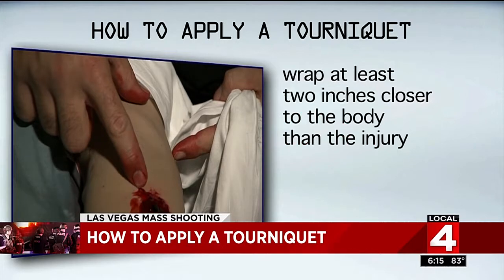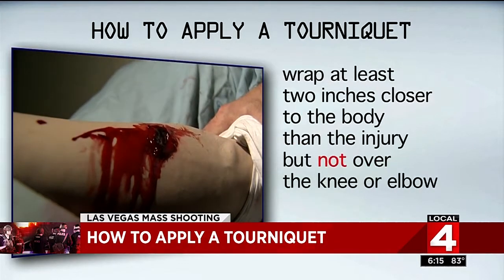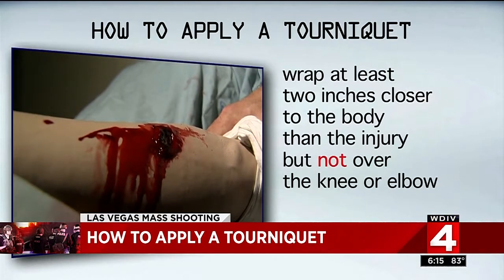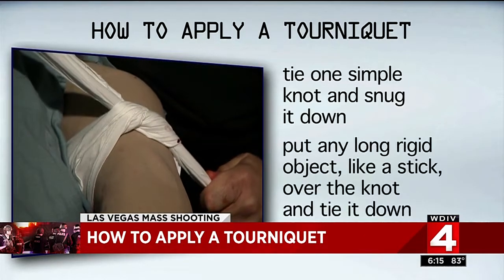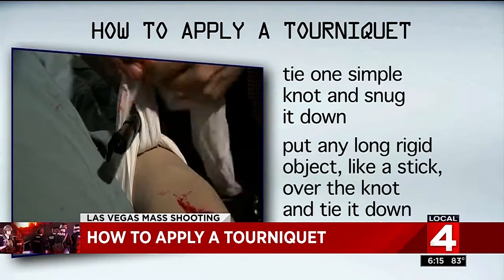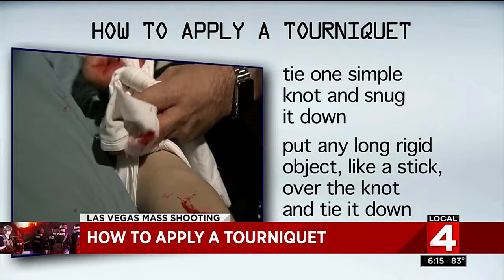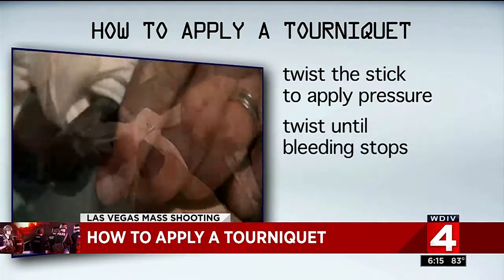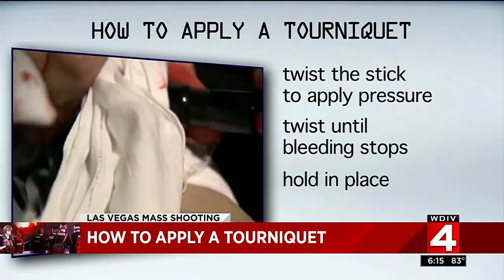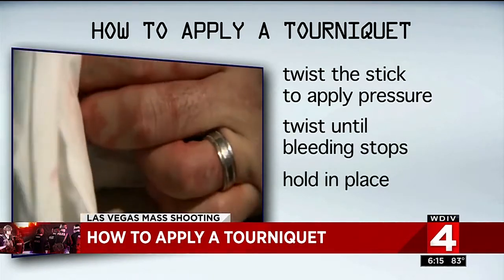Wrap the tourniquet around the limb at least a couple inches closer to the body, but not over the knee or elbow since those areas can't be compressed. Tie one simple knot and snug it down. Then put any elongated, rigid object like a stick over the knot and tie it down with another couple of knots. Applying pressure is as simple as twisting the stick — twist until the bright red bleeding stops, and keep the twisted part from unraveling by holding it in place or tying it with remaining fabric.